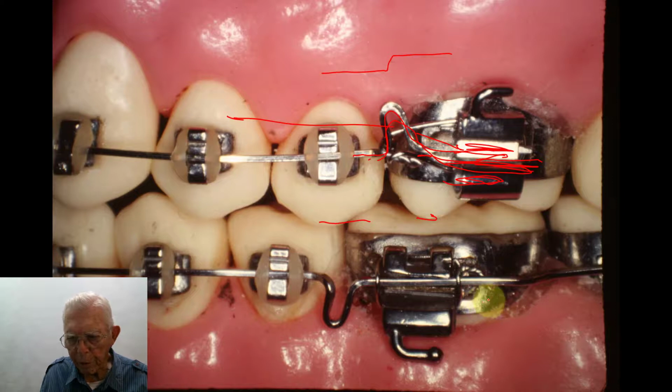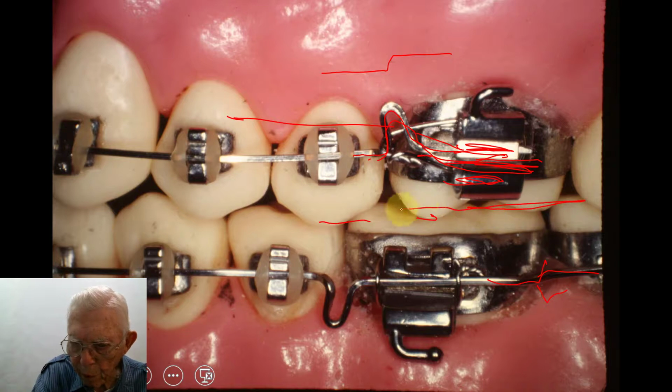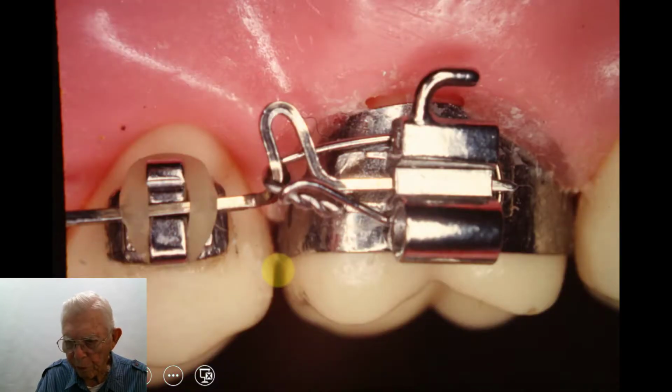Now, on the bottom arch, your bands, you never can know exactly what to do to the bands themselves. And so a lot of times you have to adjust your arch wire to that. So if your band or the tooth is off size, you come out and then you bend the wire in like that, or you go up or you go down to keep the incisal edge of the molar teeth in line out here. You may go in or out or up or down with it. And now you have to convert this slot that is as a tube. You peel this tube off right here, and now this has to be tied in the same as a bracket out here in this area to make this thing work. So we go on from that point.